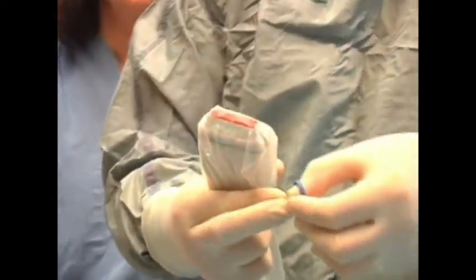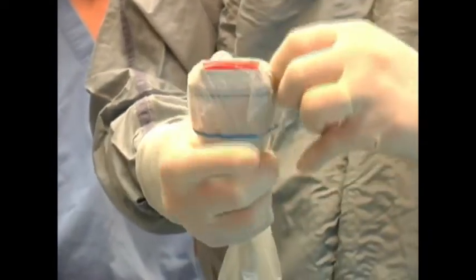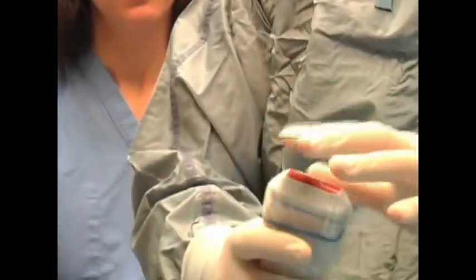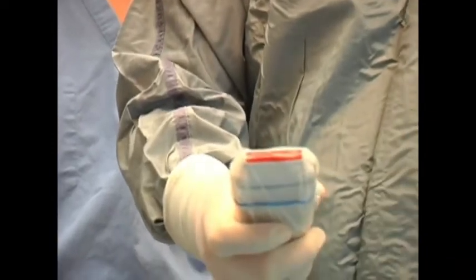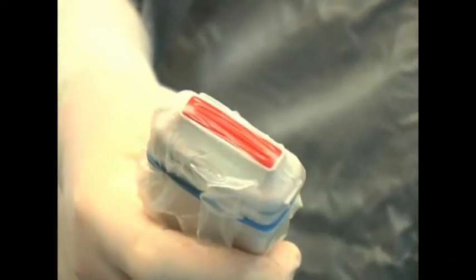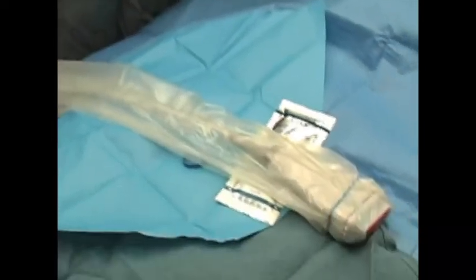He applies the rubber bands, one near the top of the transducer and one further down on the cord, to keep the transducer cord sterile. He'll smooth out the gel underneath the sleeve, and then he can apply the sterile gel to the top of the transducer. Or he can wait and do this when he's ready for the procedure. And now we can actually lay the transducer on the sterile field.